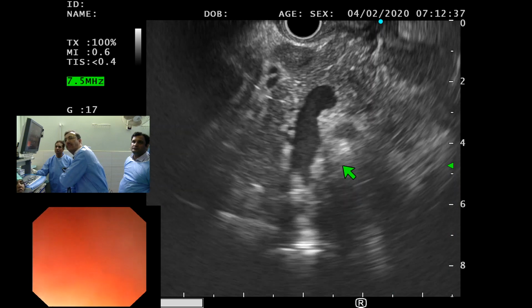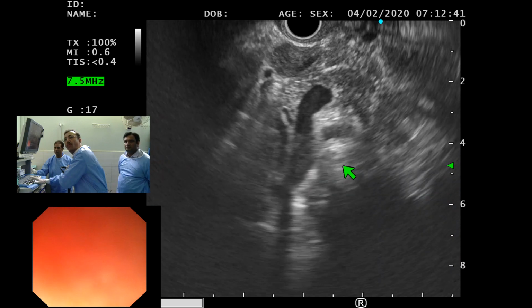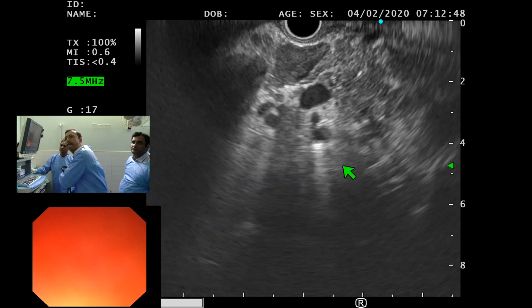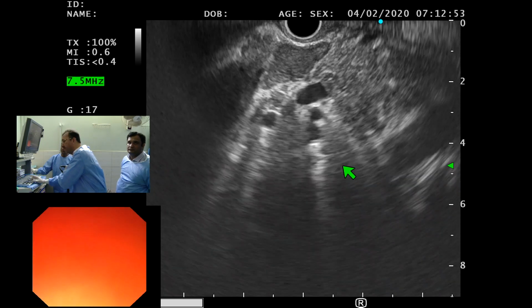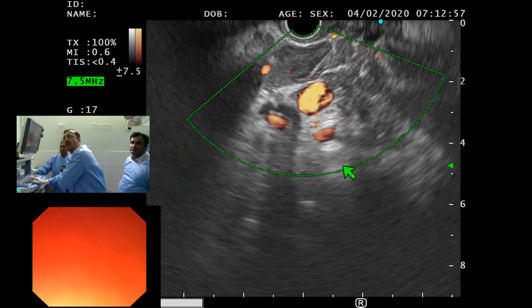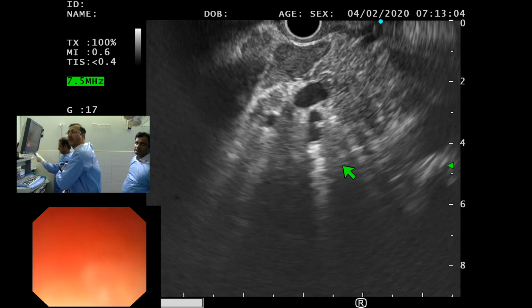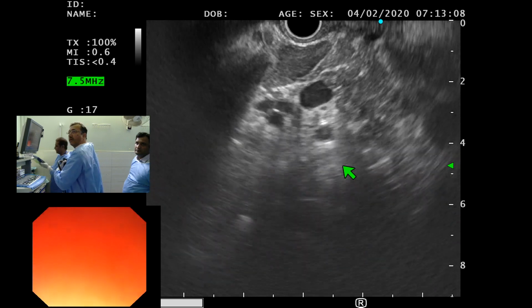Okay, so you've almost seen it till the pancreatic mass, there is none. So you've only seen a big lymph node and that's it. Yeah, that's the only thing. Do you want me to biopsy the lymph node? Yeah, I think so. We should be doing a biopsy of this lymph node. Okay, go ahead. This is a reasonably big lymph node. Sure, go ahead. 22 FNB.